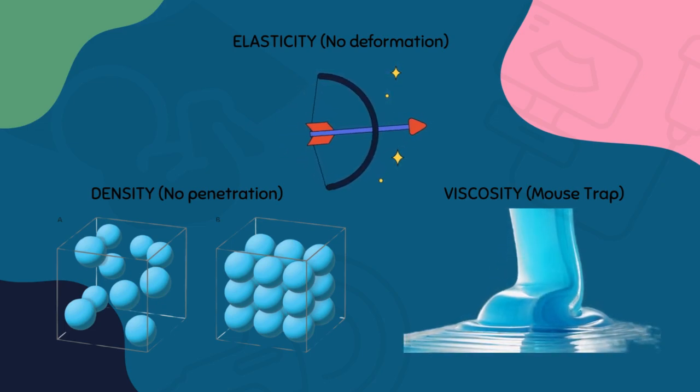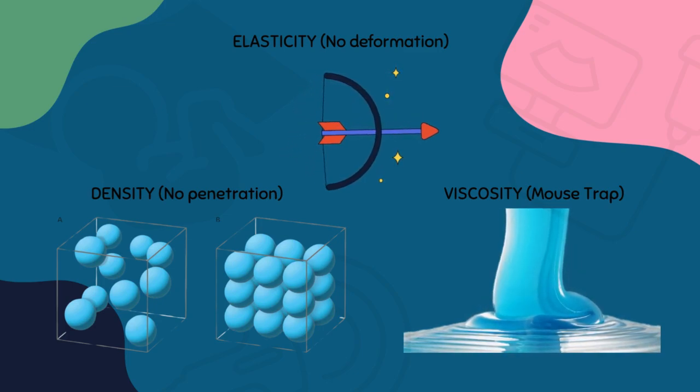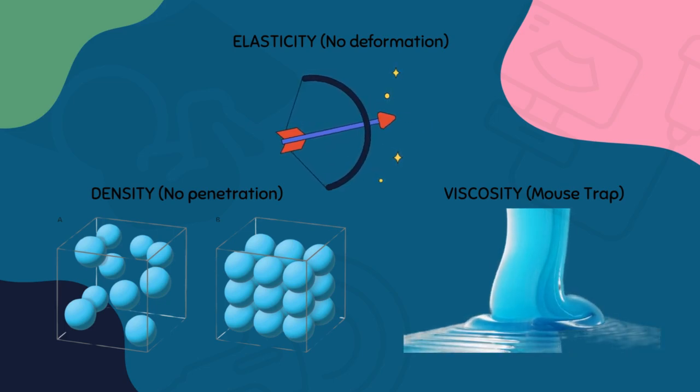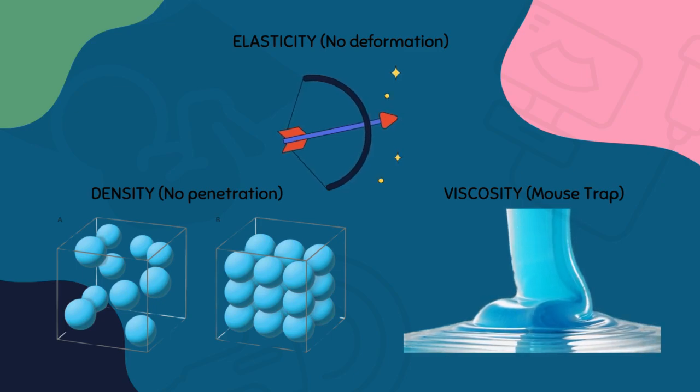On the other hand, less dense tissues will have large intermolecular spaces that allow for easy transmission or penetration through the tissue depth.